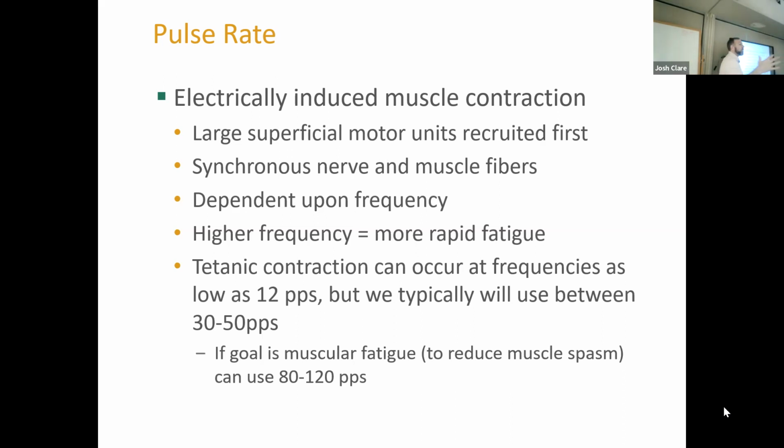We're going to do it for so much until you fatigue. And guess what? When a muscle fatigues, what's it do? It's got to stop contracting. So there is a thought process where we could use that. What do you guys think of our patients? They're not going to like that, right?